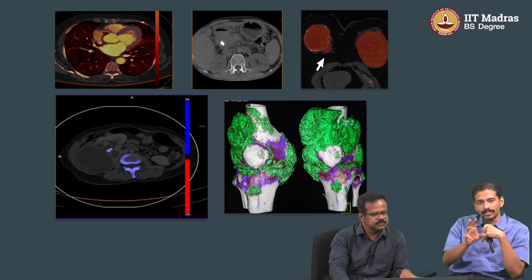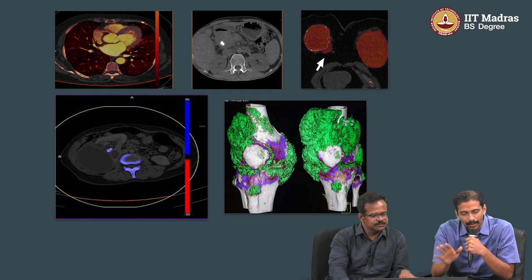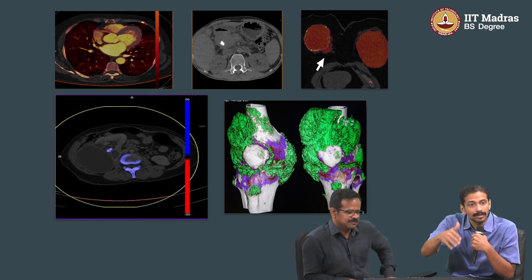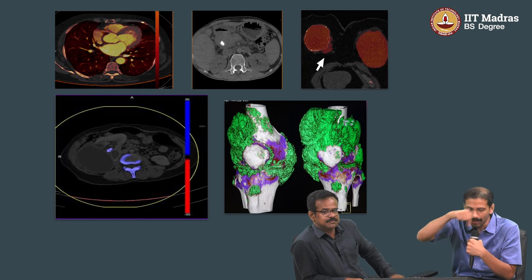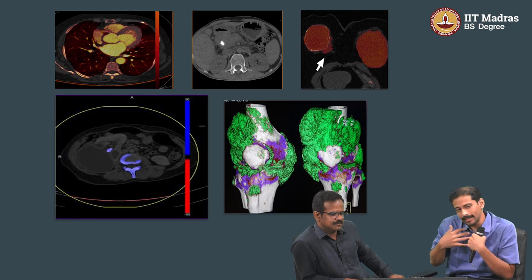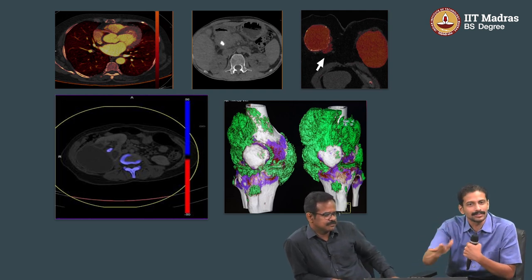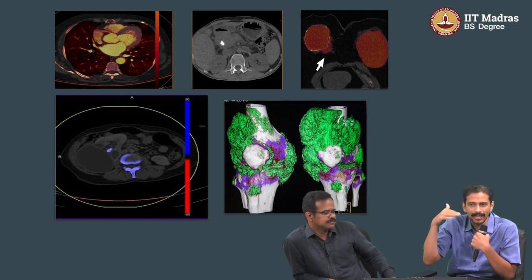If I can give an analogy, you know 3D printing, right? Imaging is the exact opposite of 3D printing. Even 3D printing is done in sections: at one point you do a section, then another section, another section, climbing up, like building an apartment. Our body is a 3D structure. You now slice it, the reverse of 3D printing. This is exactly what it is. Once you understand that, that is nothing but what we mean when we mention slices and sections.